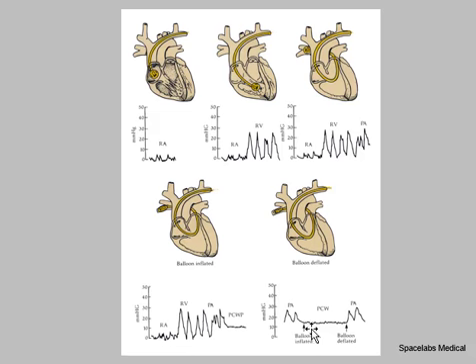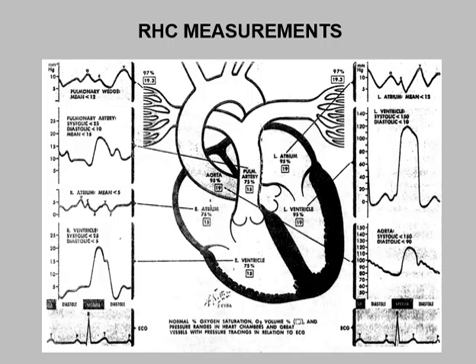The reason they do that is that they need to twirl and twirl and twirl the catheter, and if it's connected to the pressure sensor, they're restricted in the movement. So they do all the twirling and then they connect, and that shortens the case and makes it easier for everybody. This is that slide I showed you in an earlier lecture.